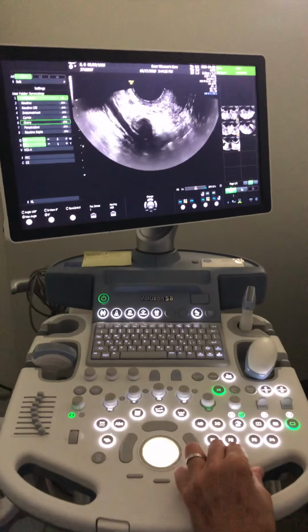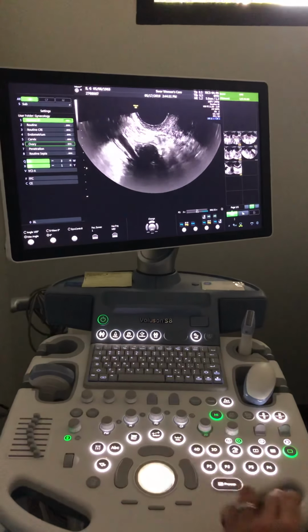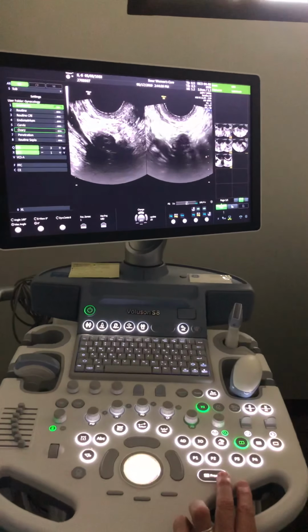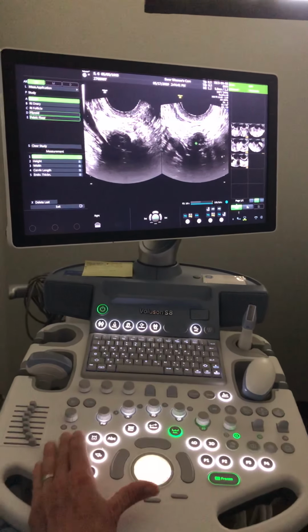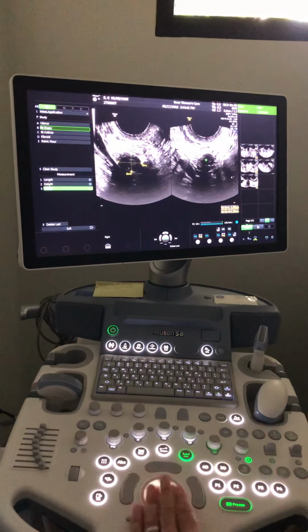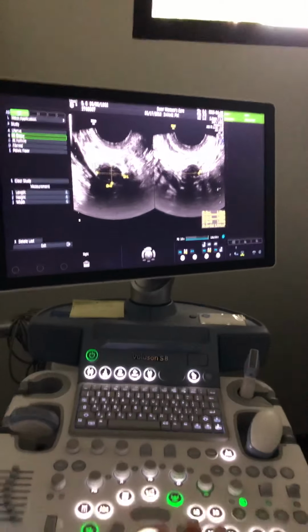And I can see the ovary. It's that dark oval shape. Sometimes it's mid-range echo. Sometimes it's actually lighter. A lot of ovaries are darker. I'm gonna split the screen for the right ovary. The set button. I'm gonna turn 90 degrees and get a transverse view like that. And then calc, roll up to right ovary, click it, roll the cursor, set, roll the cursor, set, and so on. I've got all my measurements of the right ovary, and it gives an ovarian volume. P1 to record.